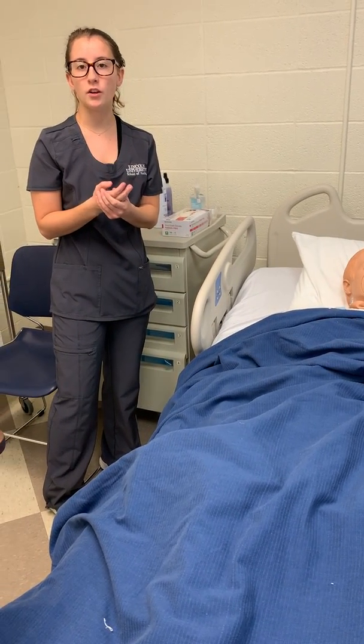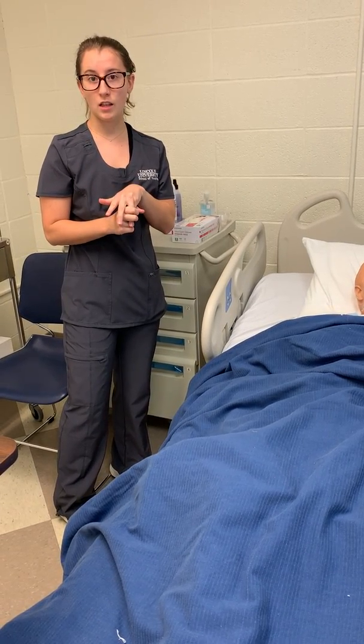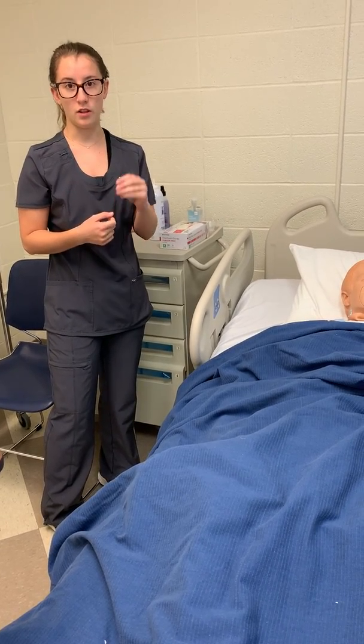And I'll go ahead and document the type of catheter and the size that I used. If I did collect that urine sample, I would document that as well. And then I also dated, timed, and initialed the catheter that I did.